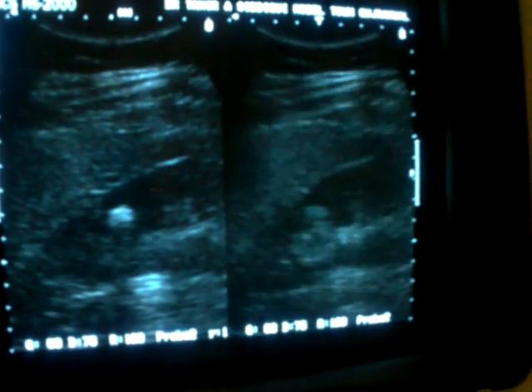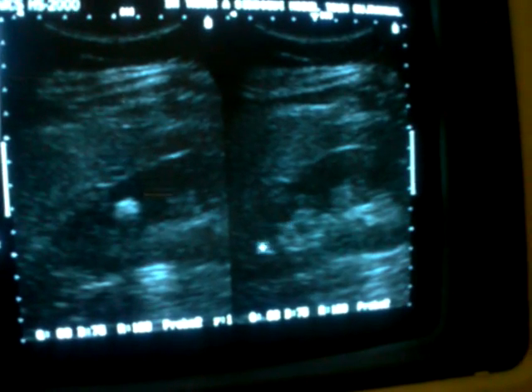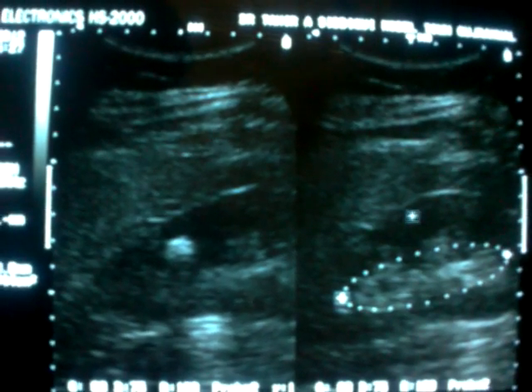This is the longitudinal section of the right kidney. This is the right kidney — here is the upper pole, the main region, and the lower pole. You can see the echogenic area, which is in the region of the medulla and is not in the central sinusoidal complex. This image shows the central sinusoidal complex — this white area. This is the capsule of the kidney and this is the cortex.